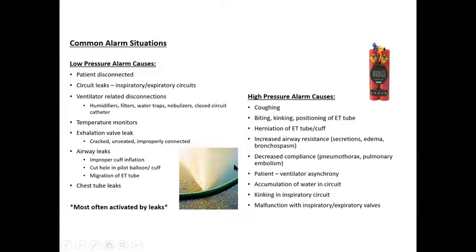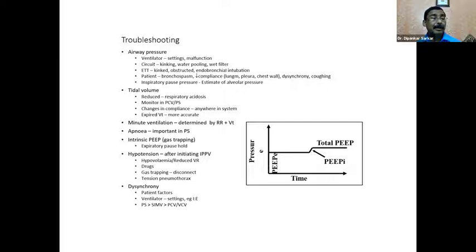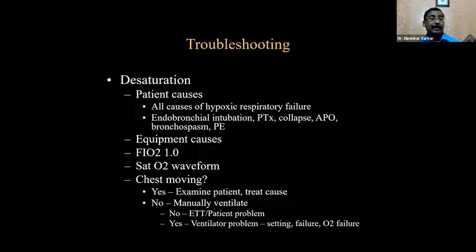Common alarm situation: low pressure alarm. So this, we have discussed time and again. Now let's come to the troubleshooting part. Unexpected ventilator response.